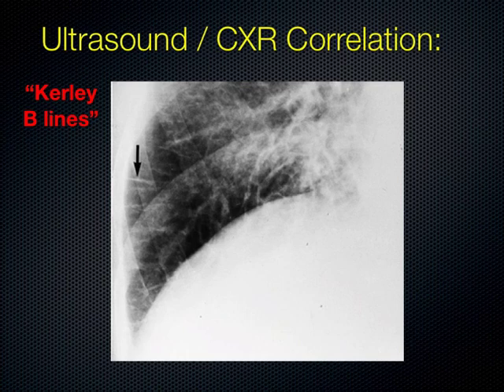Okay. We're going to move on. We'll have some time at the end for more questions about A and B lines, but we're going to move on to ultrasound of pneumothorax.